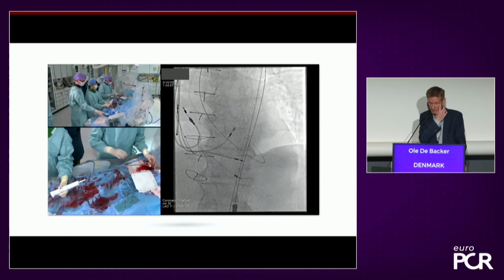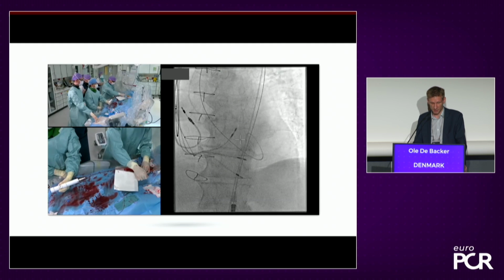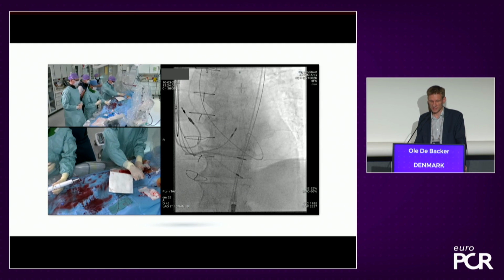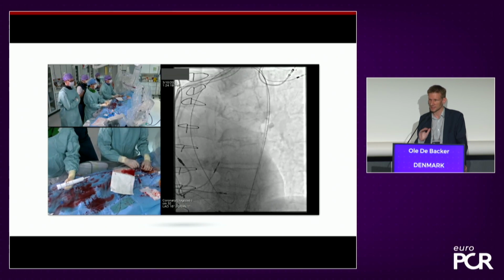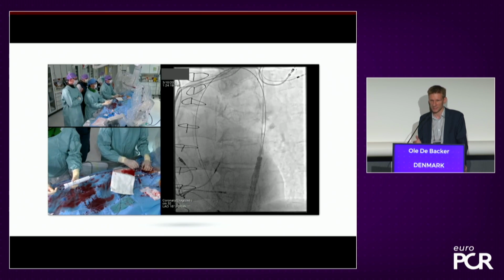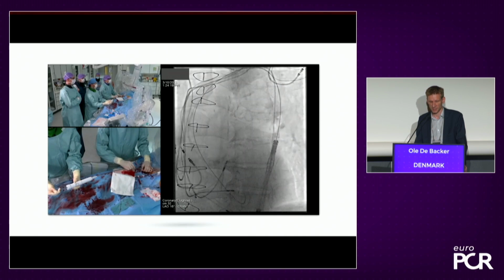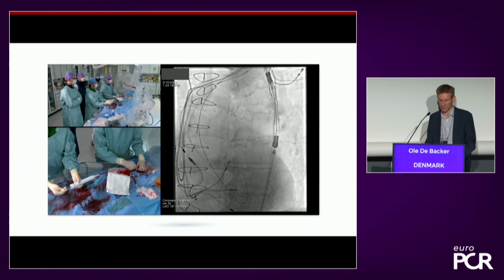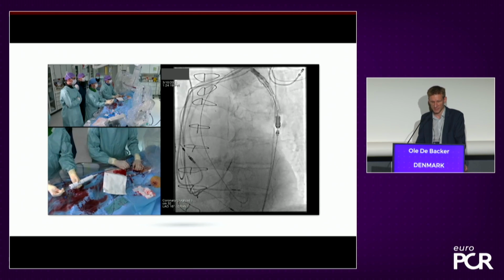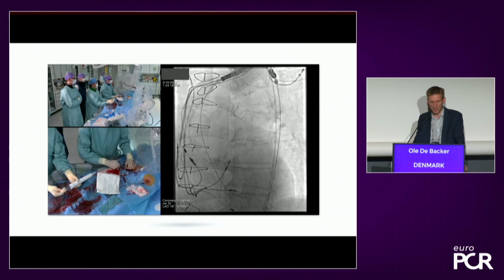So here, this is that particular Accurate device. Here we have the Safari wire in place. And you see all this goes rather easily through the expandable sheath, this eSleeve. As soon as you get an introducer sheath through, also if you work with expandable sheaths, be it Edwards or this Accurate, for example, you will also manage to get your TAVI device and your delivery system through. You feel a little bit of resistance, but nothing particular.